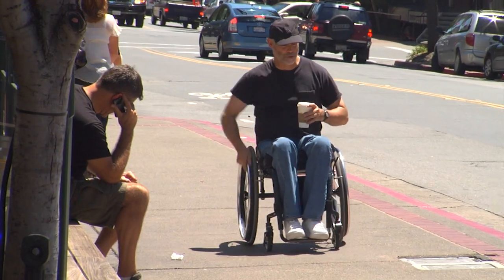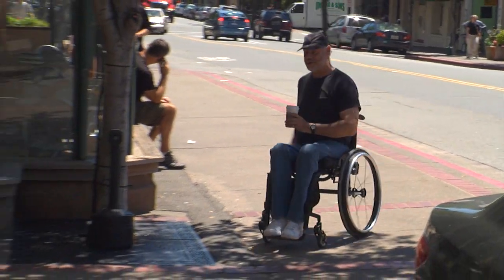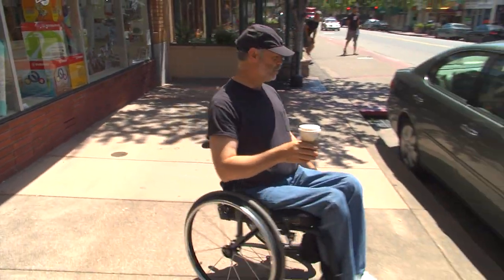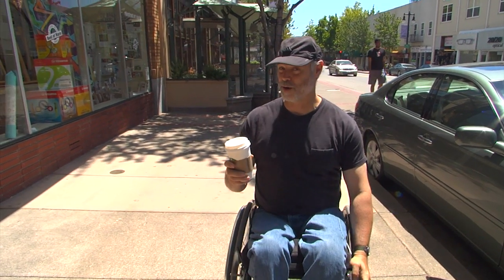The most important thing, of course, is stopping safely — because when you stop with one hand, you make a circle. So you pick your spot and let yourself naturally spin around, which slows you down, and then you stop right where you want to be.